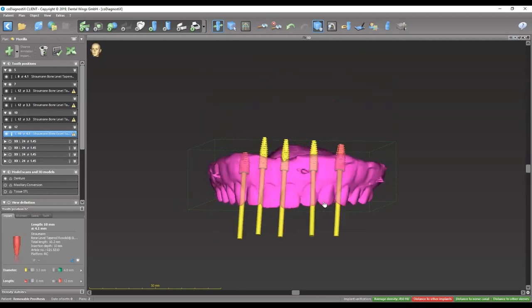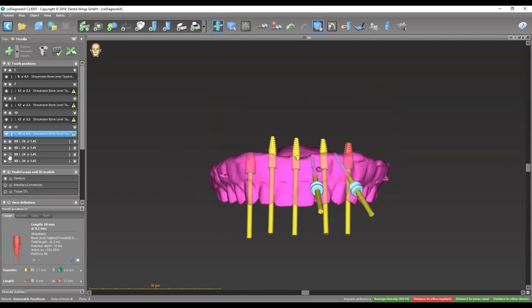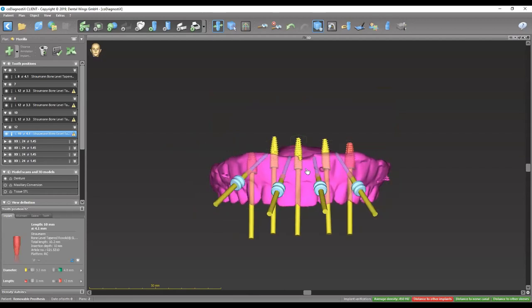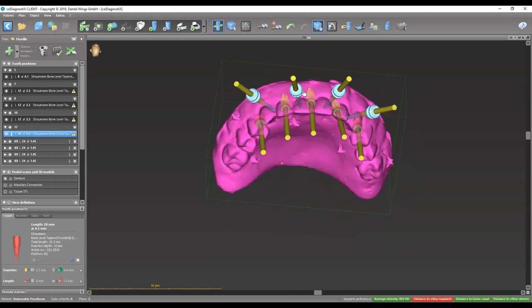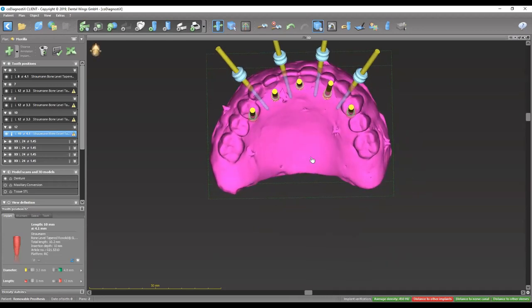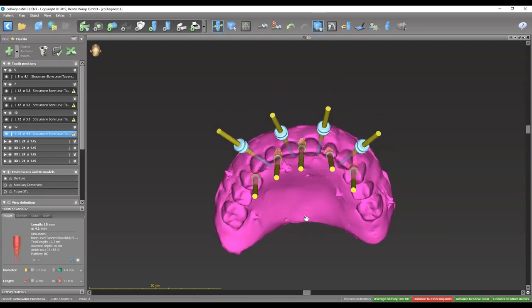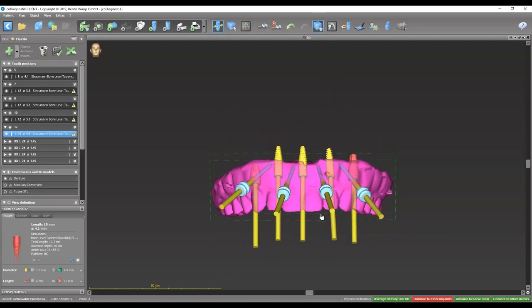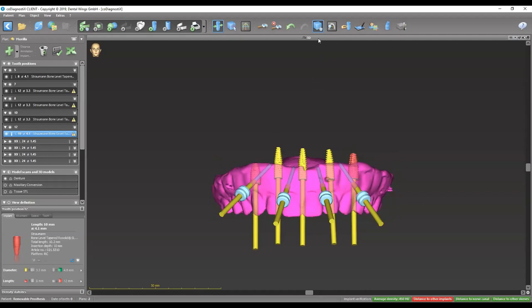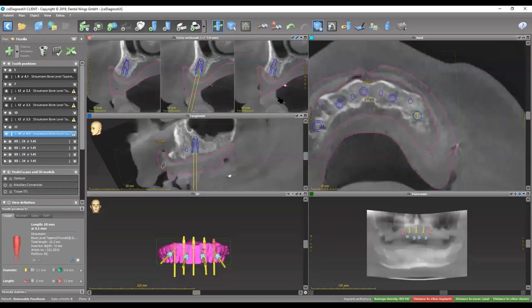We're going to go ahead and place fixation pins between those implants at a 45-degree angle to hold the guide down, whether it's tissue-supported or bone-supported. It doesn't matter whether we have a dual scan or not — we usually use the dual scan for planning purposes, using the dentition and denture as reference, but we can still design a bone-supported or tissue-supported guide. That was the part where we designed a case for an overdenture.